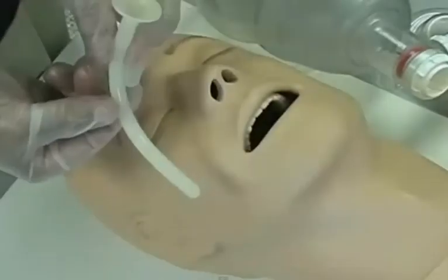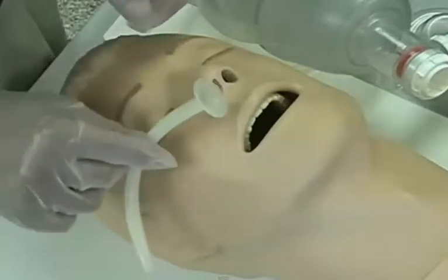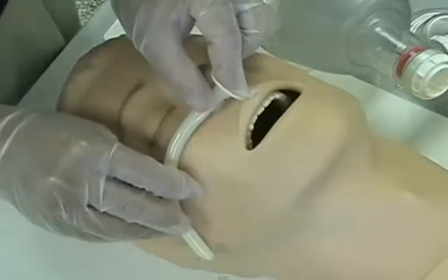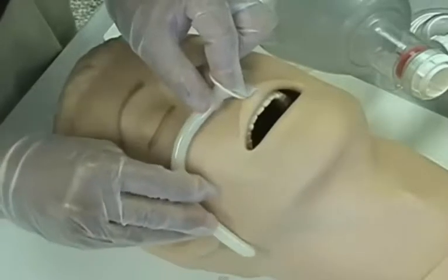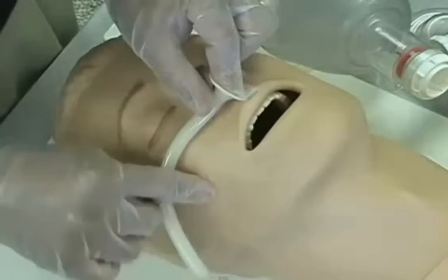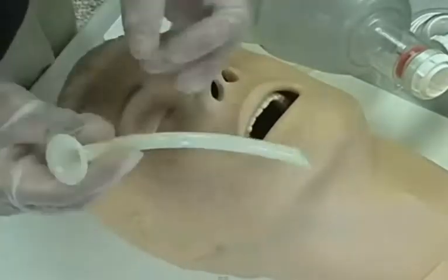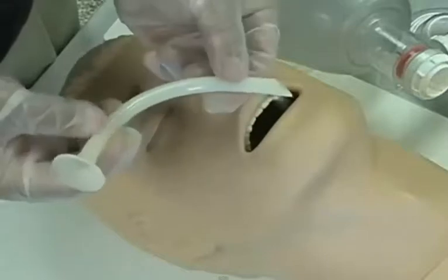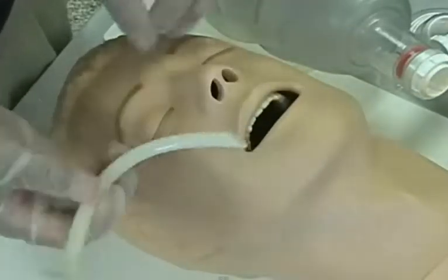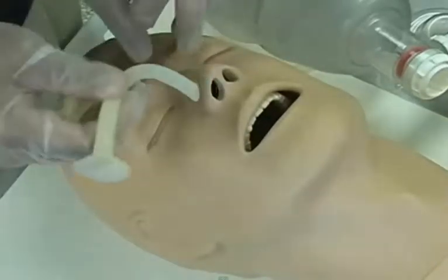For insertion of a nasopharyngeal airway, proper sizing is also important. Most textbooks will recommend measuring from the nose to the tip of the earlobe or the angle of the jaw. It's important that we get at least this far to bypass the tongue, which is the whole reason we use an airway. It's also important to use a proper lubricant so that we don't have to force it in place, it slides in smoothly. Now we normally use the right nare with the bevel towards the septum.